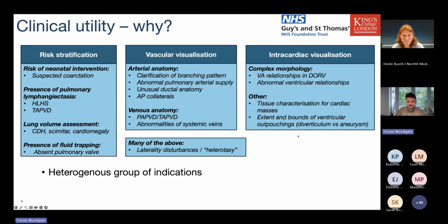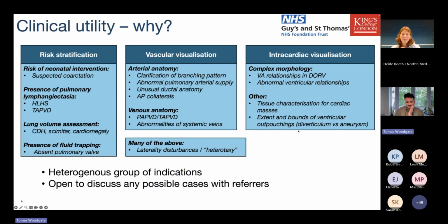But the point here is that it's a really heterogeneous group of indications and cases that we see, and it's not limited to this. We're really open to discussing any possible cases with our fetal cardiology team, if they've got any queries about a case where they're wondering whether we may be able to add anything with an MRI.